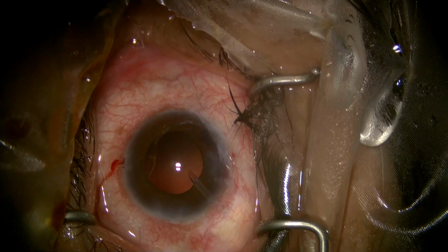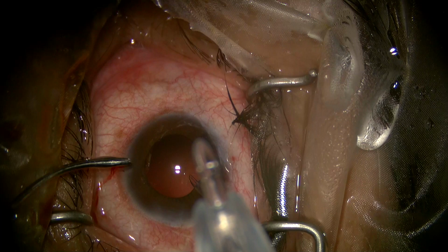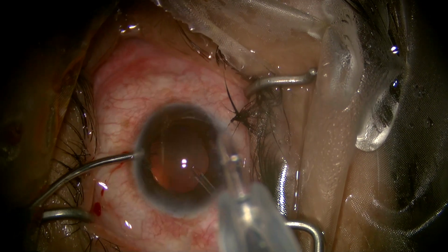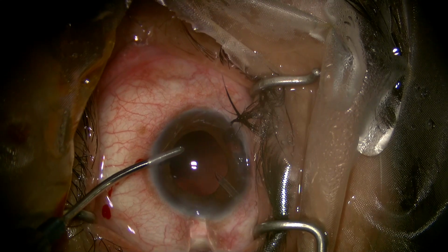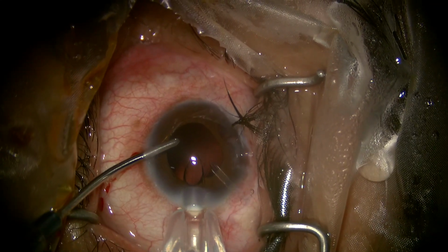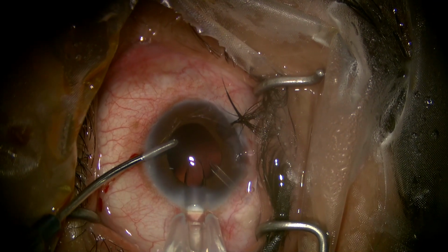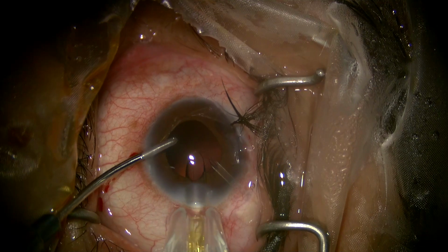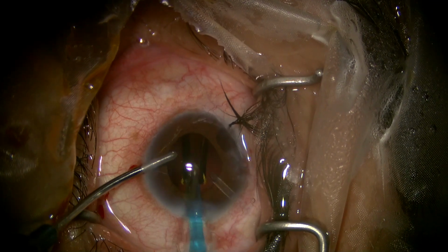So the clue is, because it's supposed uveitic glaucoma, uncontrolled glaucoma in which TRAB and AGV have already been done, we have to do the routine phacoemulsification without touching the iris or uveal tissue, and also simultaneously do the controlled removal of the nucleus and the cortical fragments.